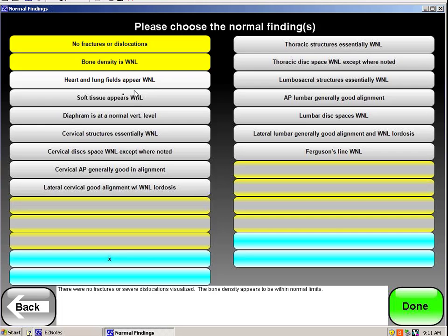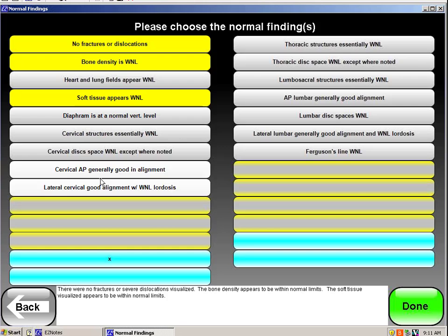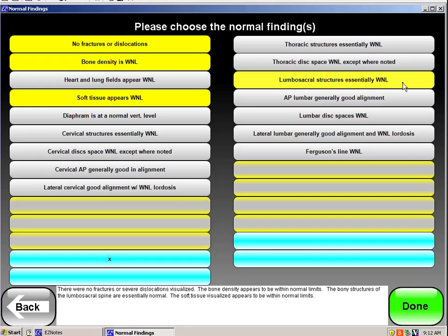The soft tissue is good. There's no hematomas. Now we're not dealing with any cervical or thoracic structures, so I go right to the lumbosacral structures, and they look normal.